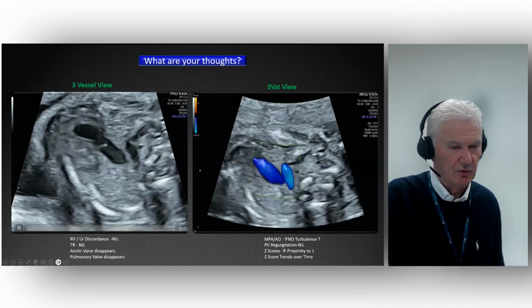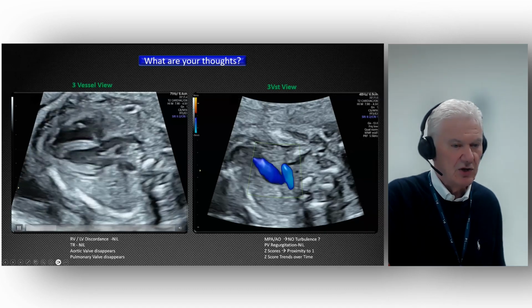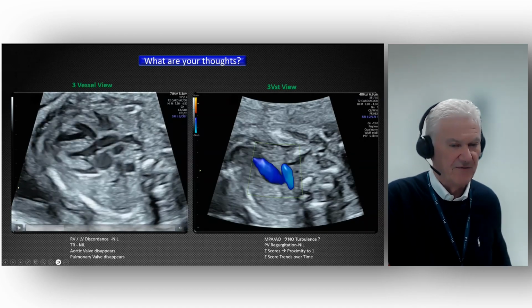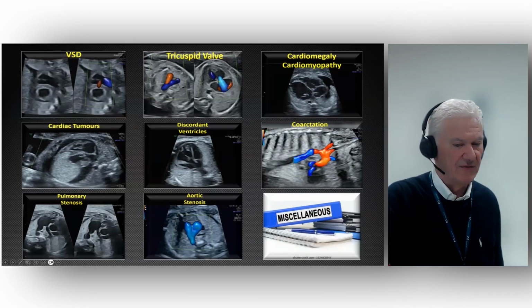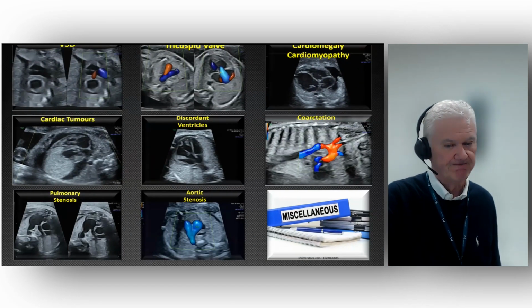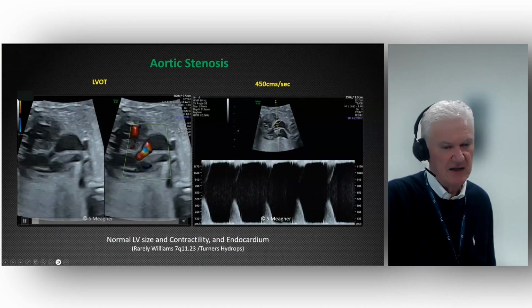I think we can improve. So you go to work tomorrow morning and you see this case, you reference it to the aorta as the first step, and then you place a pulse Doppler gate over the valve, and if it's greater than 100, you're concerned. With regard to aortic stenosis, yeah, look, these are uncommon.